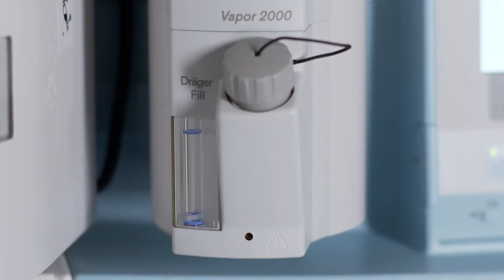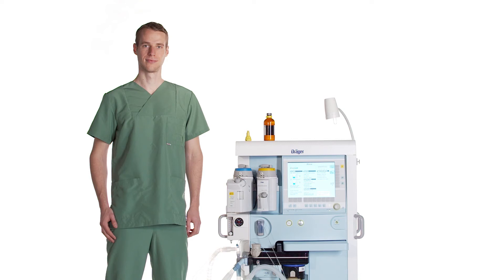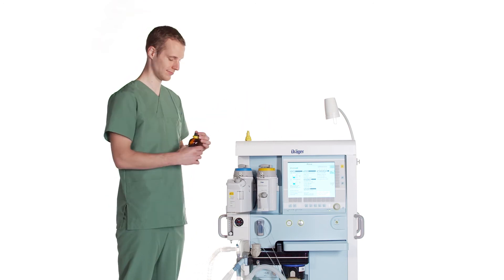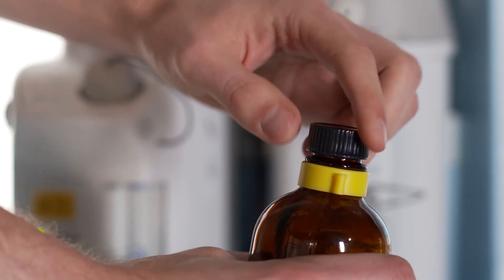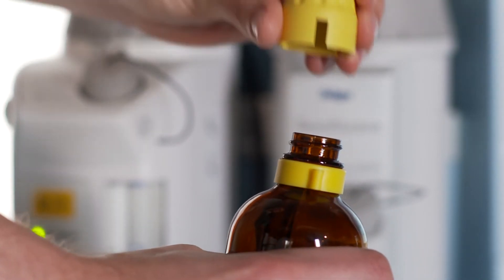Please set the Vapor 2000 control dial into the 0 position. Select the Drega fill filling adapter for the particular anaesthetic agent. Open the anaesthetic agent bottle. Screw the Drega fill filling adapter onto the bottle.